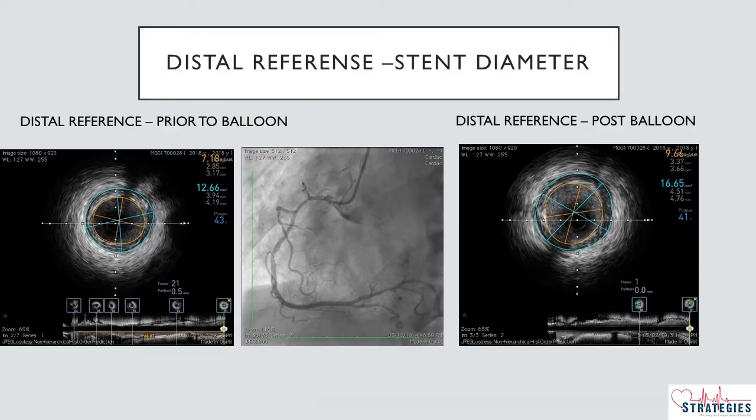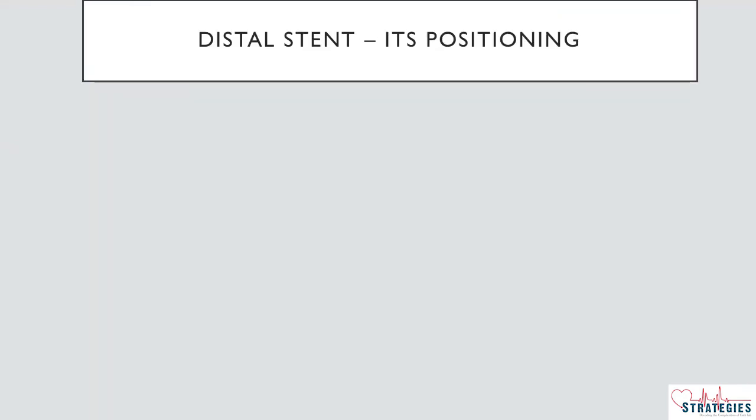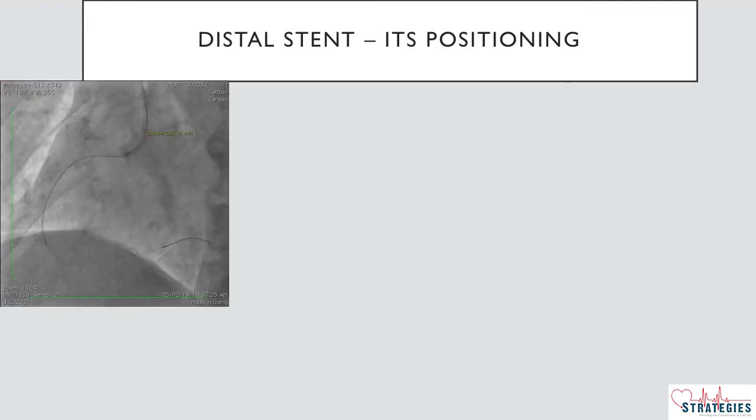In post pre-dilatation, I understood the balloon was not completely dilated in some areas. That's why I took a Scoreflex balloon, and we went up to high pressures with it.